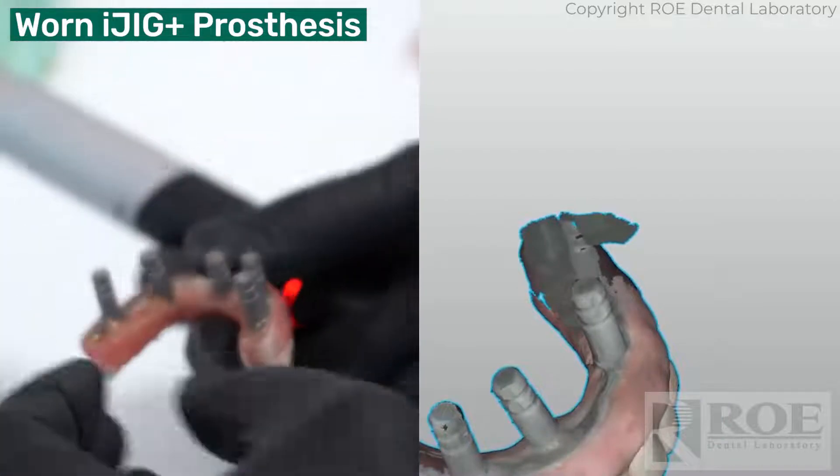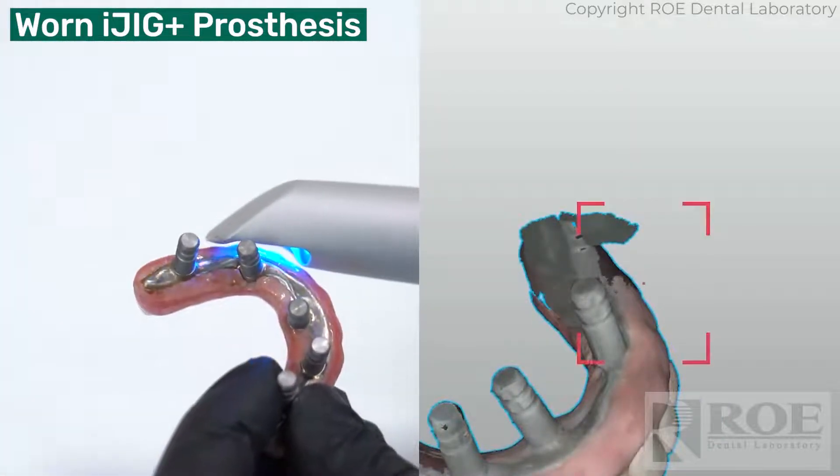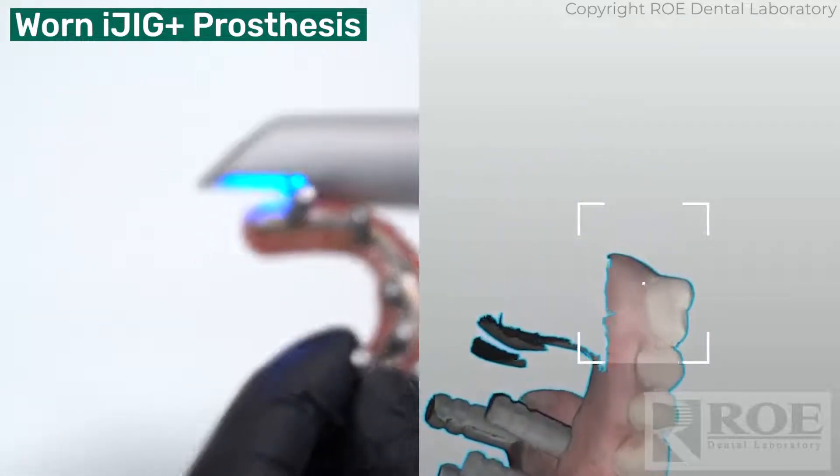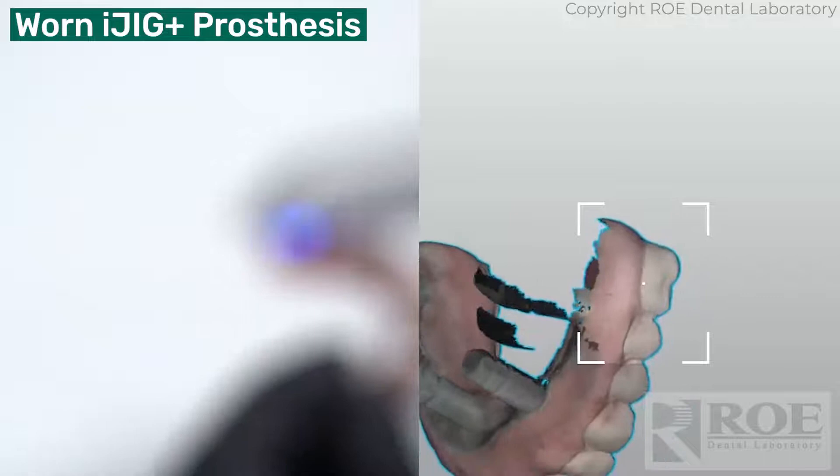Now we just have to get the one where my finger was. There we go — wow, this thing really picks up nicely. You don't always experience that with all scanners.